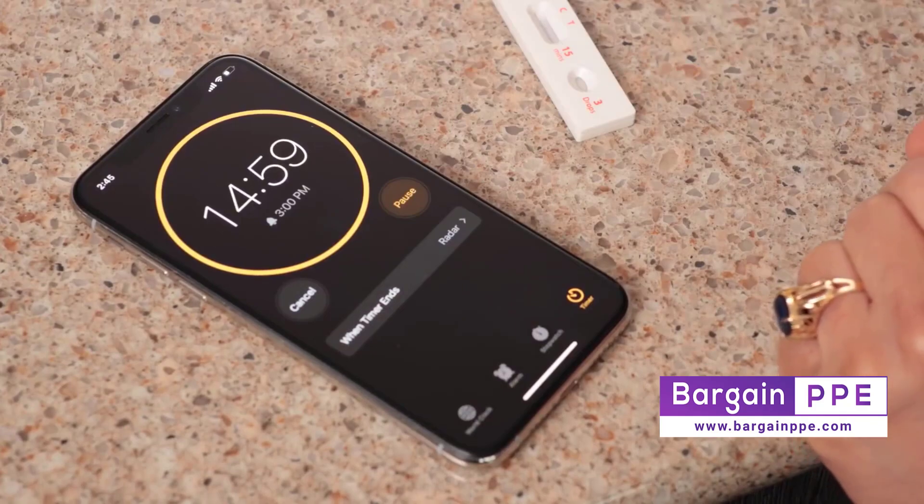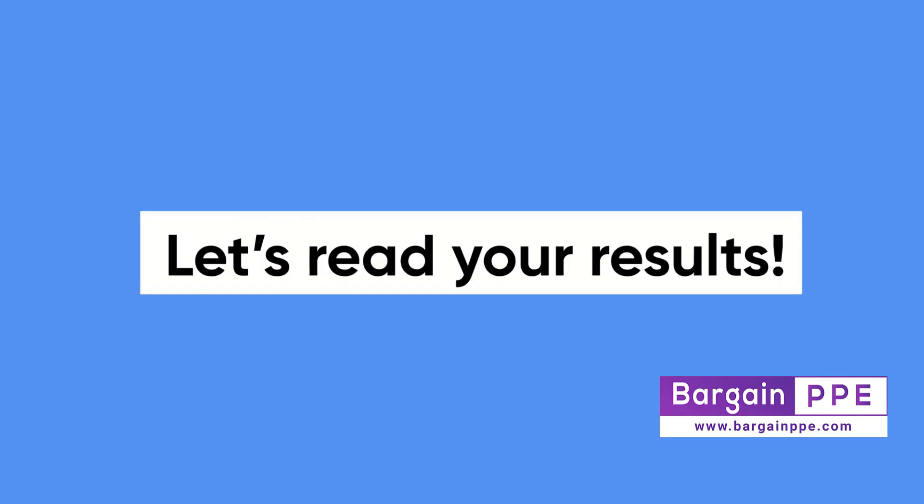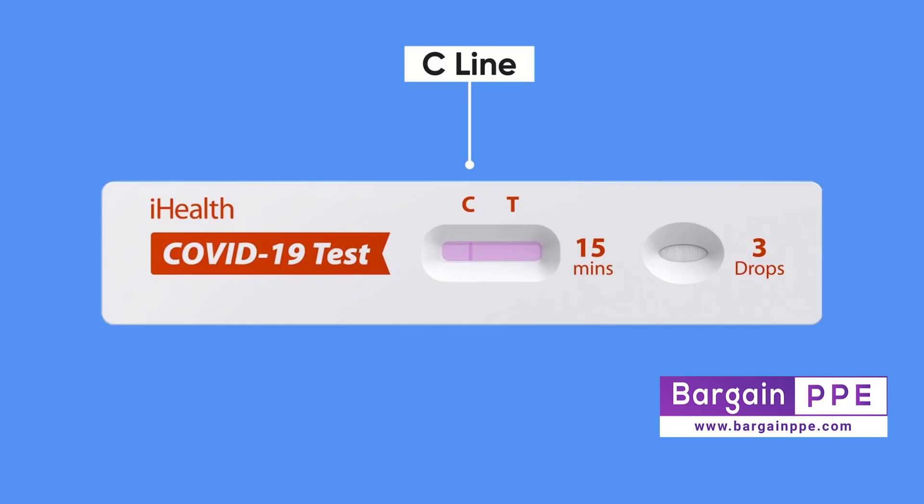It's a good idea to set another timer. Let's read your results. The C line is the control line — a line should always appear under the C. This tells you that the sample has been absorbed into the strip and that the test card is valid. If no line appears under the C, then the test card is defective, and if possible, you will need to test three drops of your sample on another card. The T line is the test line. A line will only appear under the T if you have tested positive for the virus. If there is no line under the T, then the test did not detect any virus in your sample.